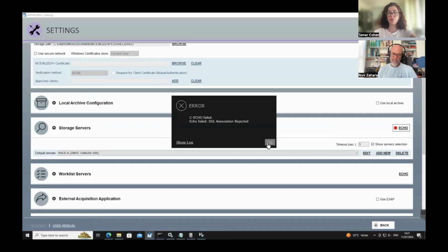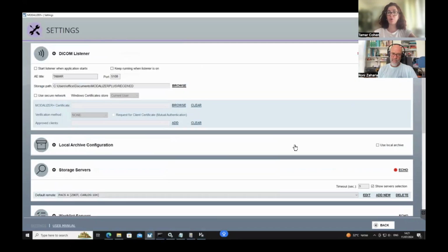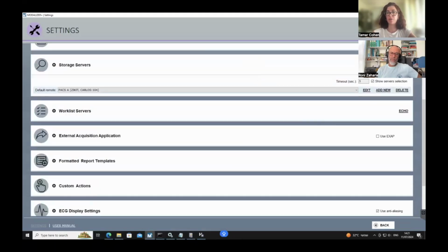So let's say you go to your PACS administrator. He tells you the AE title should look like that. And then we will go back to echo. Usually it should work.